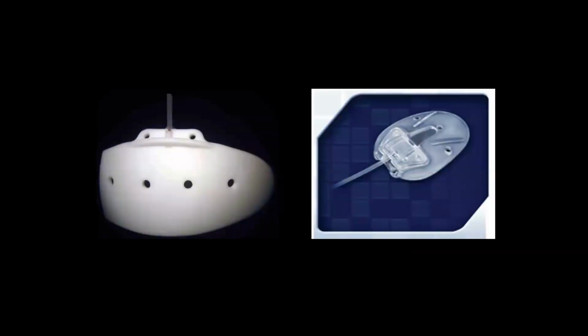So we have multiple types of glaucoma drainage devices. The most popular ones that we are using nowadays are the Ahmed implant on your right side and the Baerveldt shunt on your left side. The major difference between both groups is that the Ahmed implant is valved. The Baerveldt is non-valved. However, some surgeons have a high tendency to use the Baerveldt, although it's non-valved and there is a risk of early hypotony because there is no valve. So the drainage of aqueous will continue and you will have a collapsed anterior chamber. We can overcome this issue by having a ligating suture.